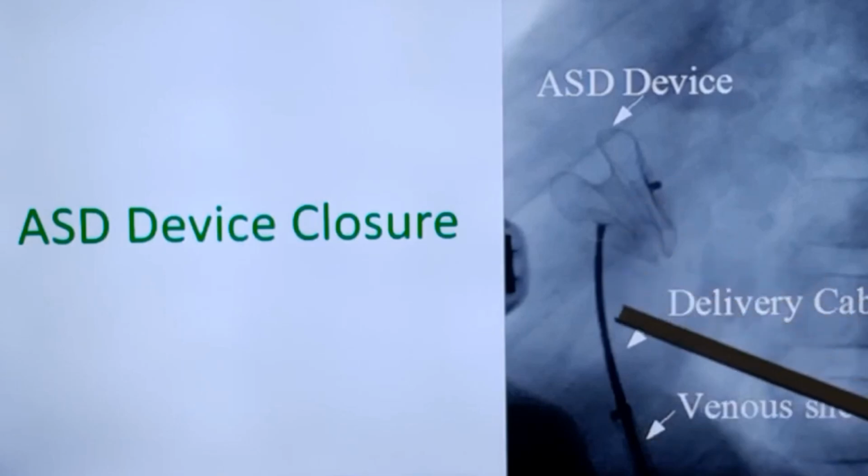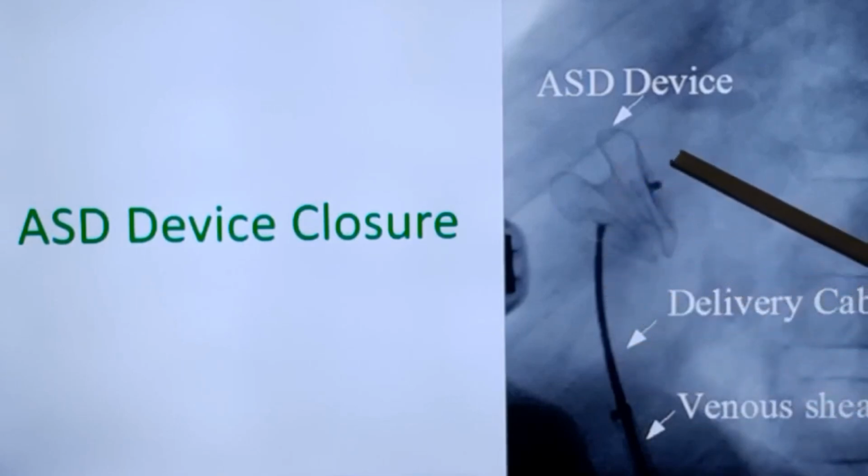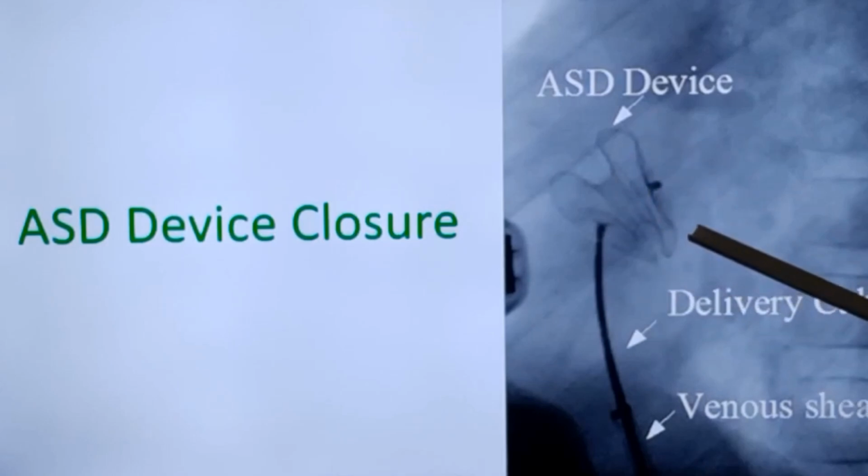This is before device delivery. Once the device is checked well and the defect has been closed properly, then this will be unscrewed and then the device will be remaining there.